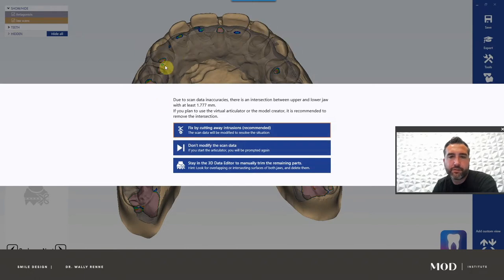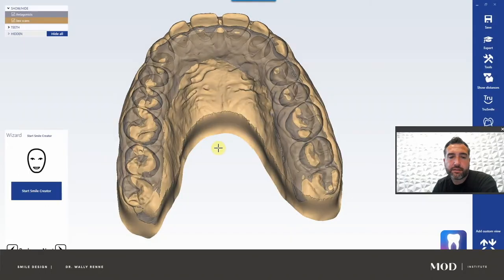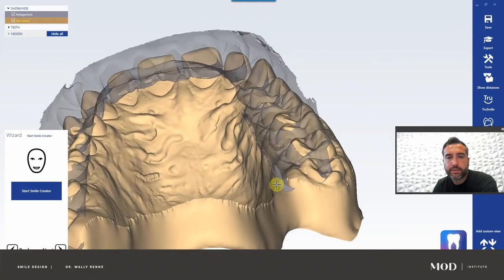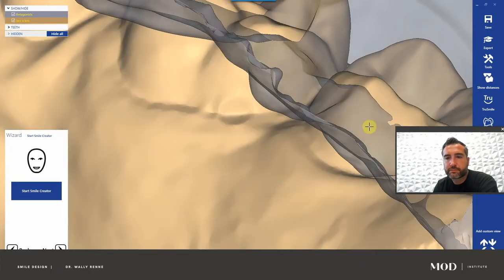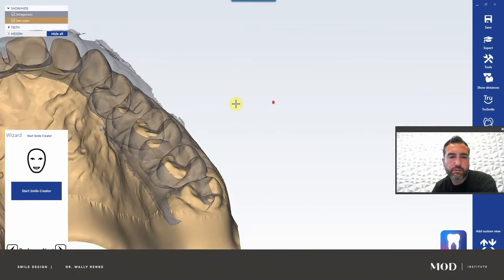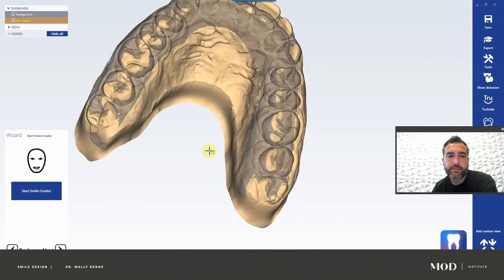Because we're probably doing a putty wash on this, I don't want to change this model too much. I'm going to hit 'don't modify the scan data.' If you hit 'modify scan data,' it would literally cut and slice the tooth surface poking through. The issue for this case is we're going to make a putty that needs to fit in the patient's mouth of this diagnostic wax up — if it altered the original model, the putty won't fit and nothing will work. So we're going to do an additive wax up.